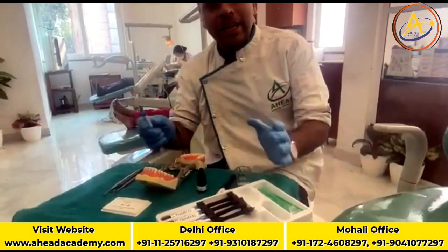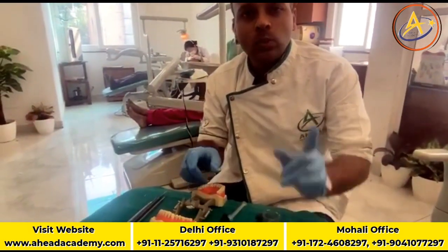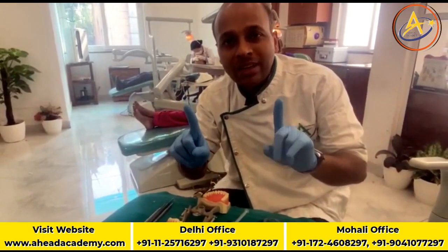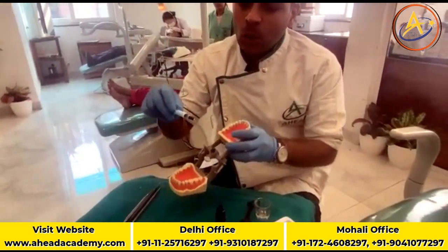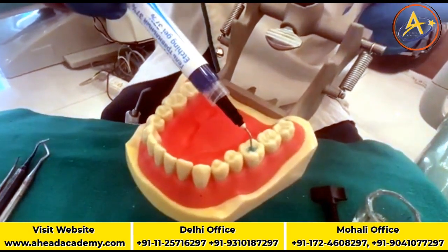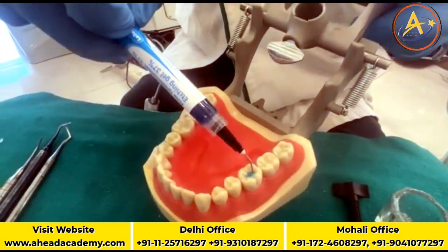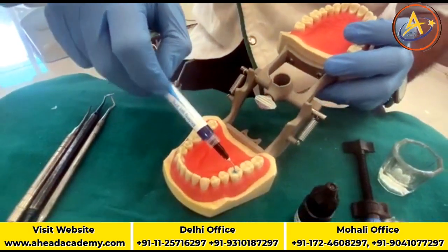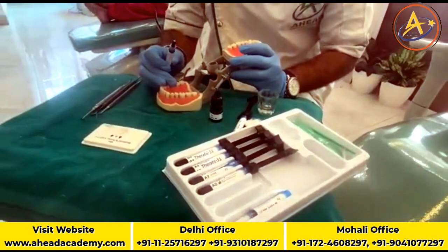In the total etch technique, as the name says, total. What do you understand by the term total? As 1 plus 1 becomes 2, that is what we are totaling. Same thing. When we are applying this etchant onto the tooth surface, are we seeing whether it is enamel or dentine? We are not seeing. We are etching the surface of enamel and dentine together. That's why the term is total etch technique.